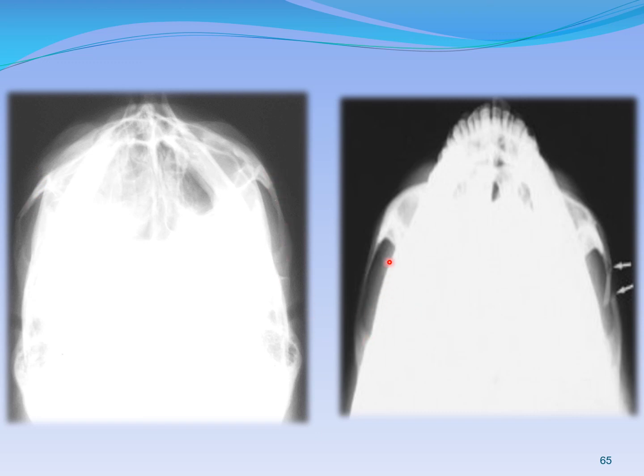In the second image over here also you can see the zygomatic arches clearly, and in the second image these arrows indicate discontinuity. That means there's a fracture of the zygomatic arch. It is termed the jug handle view because the zygomatic arches resemble the handle of a jug.